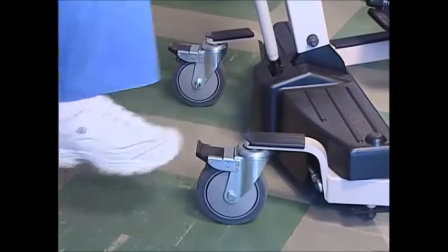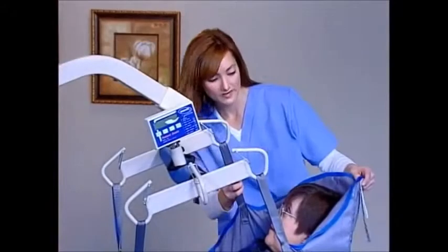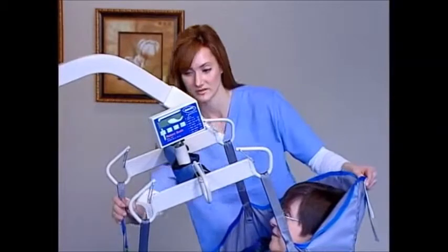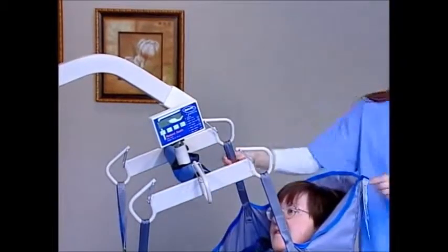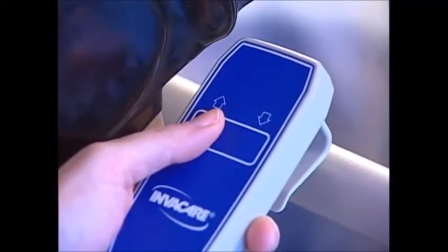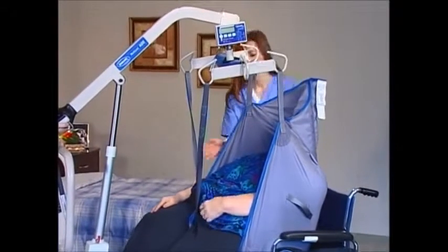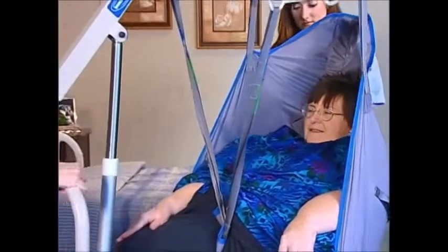Unlock the rear casters. Press the up button on the hand pendant to elevate the swivel bar and put a slight amount of tension on the sling. Double check to make sure that all sling straps are properly attached to the swivel bar. If they are not, lower the sling and fix them. Start the transfer. Press the up button on the hand pendant until the resident rises to a point just above the wheelchair. During the transfer, the other caregiver can use the sling handles to maneuver the resident.